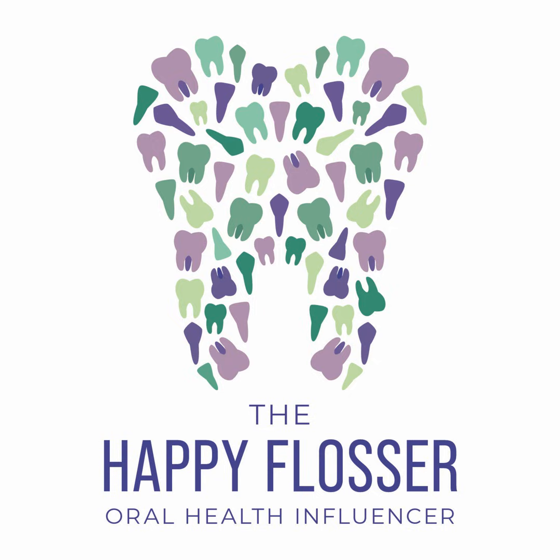And you want to make sure that you document all of your findings. Document what you see, location, size, and appearance of any findings, and any limitations of the images, right? You might say that there were 3 retakes. Or if the patient has mandibular tori, which may impede your ability to see certain things on the mandibular premolars, just as an example. I'm just throwing that out there because you want to make sure that you are documenting everything.